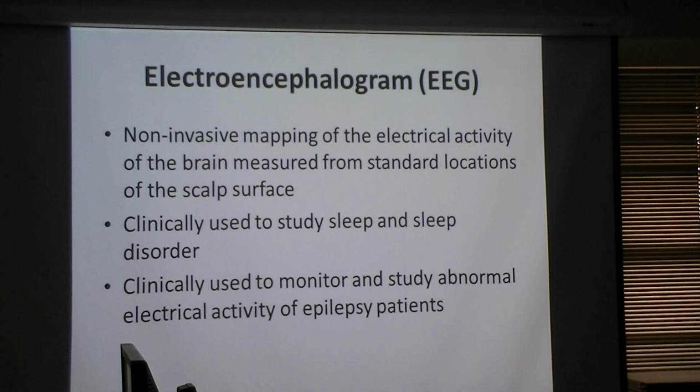Let us talk about EEG. EEG is more related to brain signals. It is non-invasive, which means we need not put any needle into the brain or into any part of the body. It is a non-invasive mapping of the electrical activity of the brain measured from standard locations on the scalp surface. Scalp means our head.